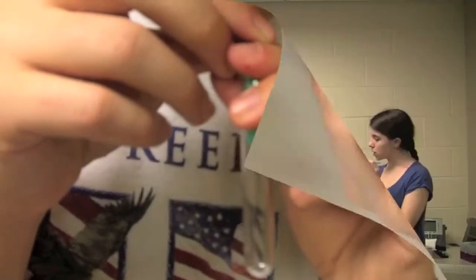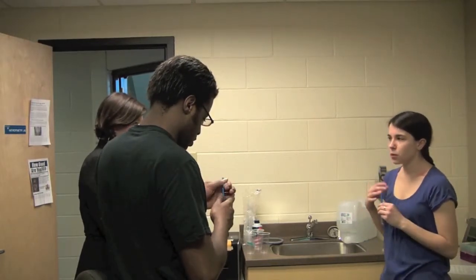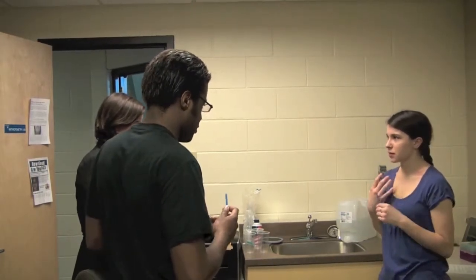One milliliter of saliva, excluding foam, is enough for most tests. If the participant's mouth is dry, instruct them to gently chew on the end of the straw. This will stimulate the production of saliva.